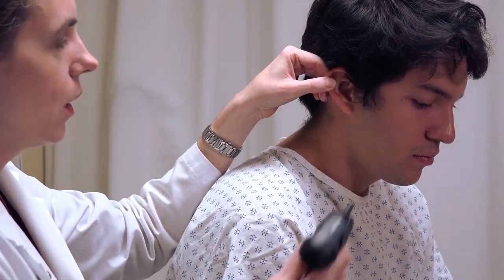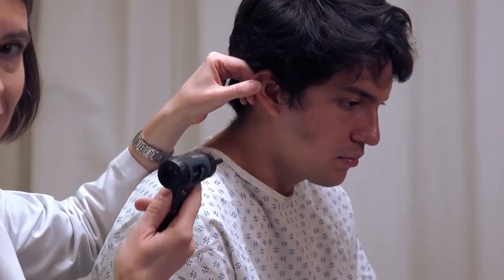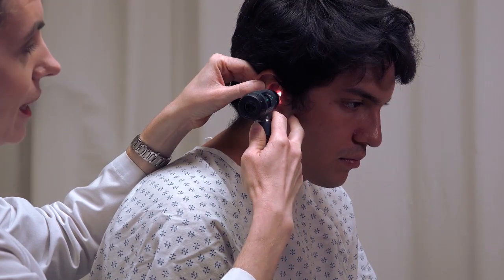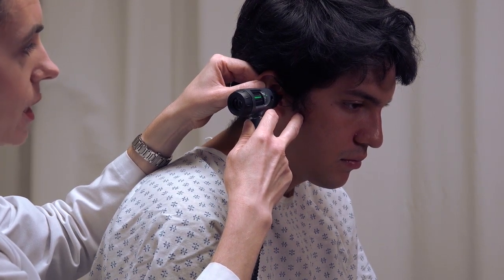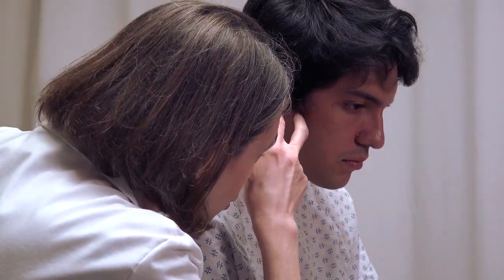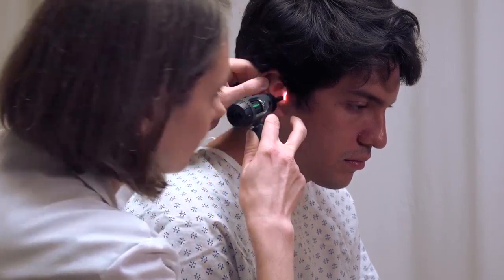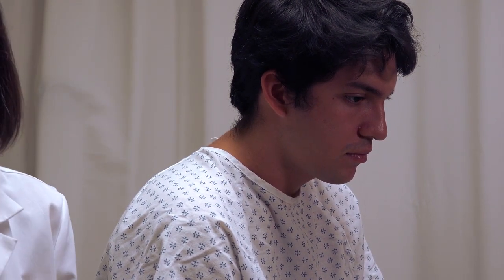When inserting the otoscope, make sure you can see the tip of the speculum actually entering the ear canal before you attempt to look through the otoscope. This also gives you the opportunity to shine the light on the external part of the ear canal and check for any abnormalities. Once you've inserted the speculum a small amount, put your eye up to the magnifying lens and adjust the angle until you can see the tympanic membrane. If you're not seeing the full membrane, adjust until you can see all of the necessary landmarks. Refer to your textbook images for the appropriate landmarks.